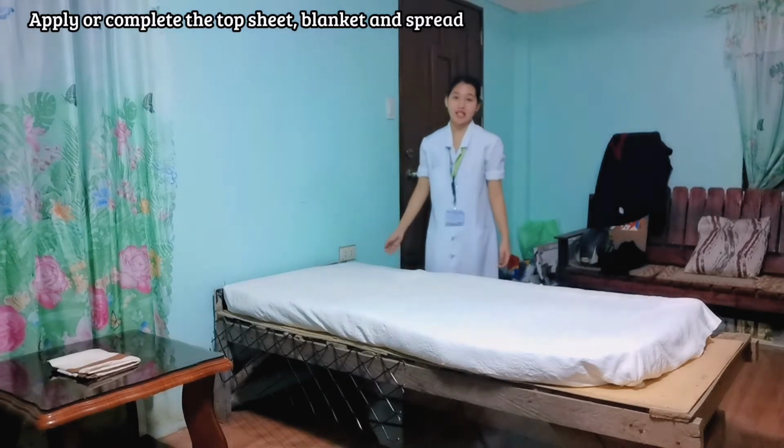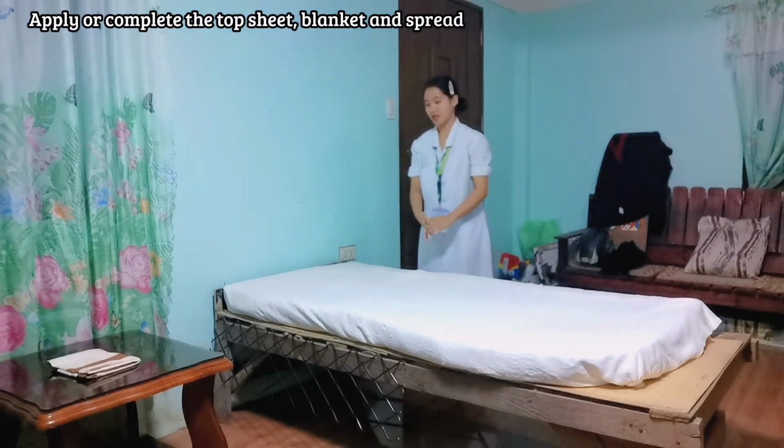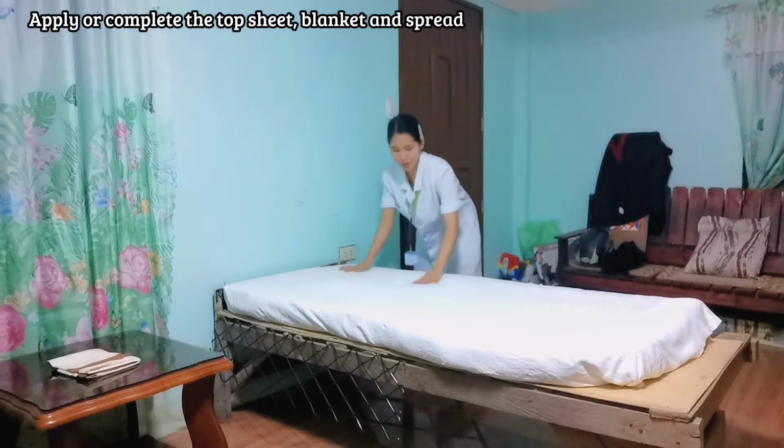Make sure that the linen is free from wrinkles, or wrinkle-free.